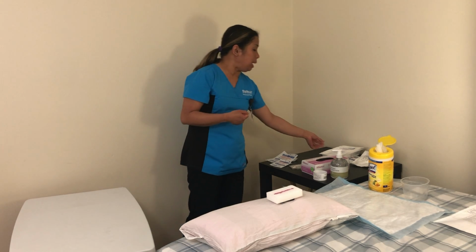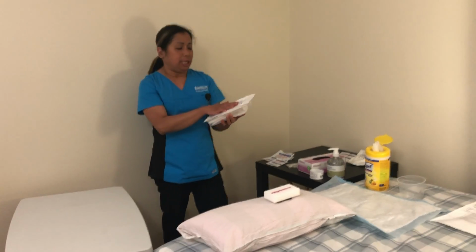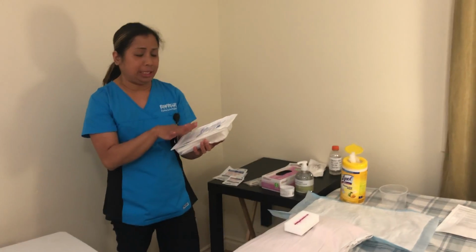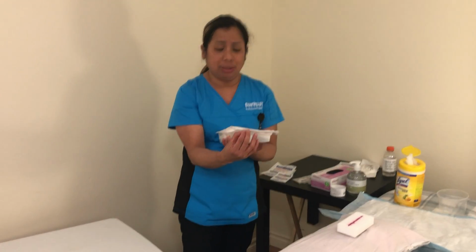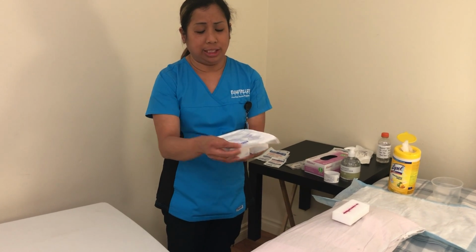Now I'm going to grab my dressing tray. Assuming it's not yet opened, and there's no expiration date written here. So I'm going to open this now, the sterile dressing tray, towards me. So this is it.